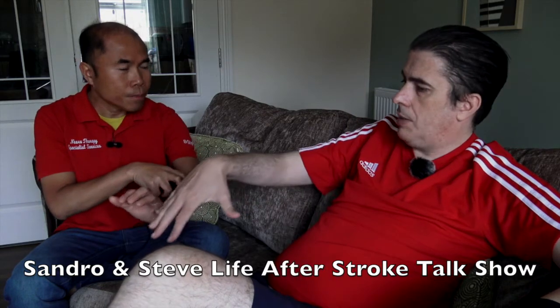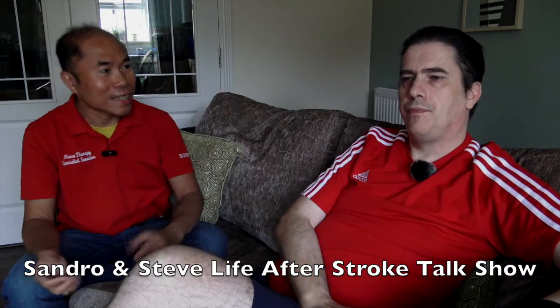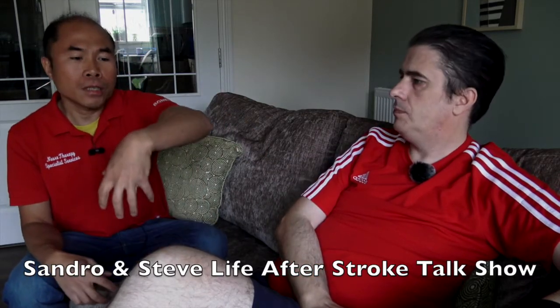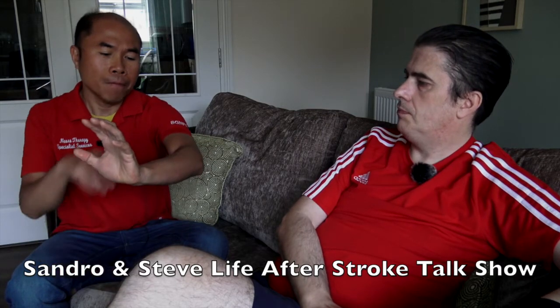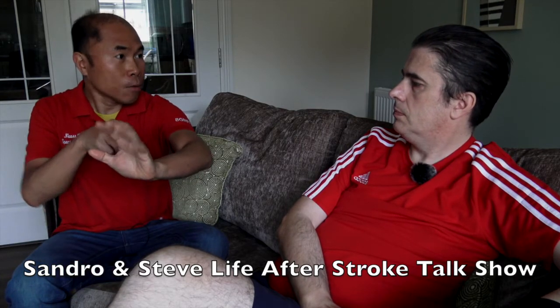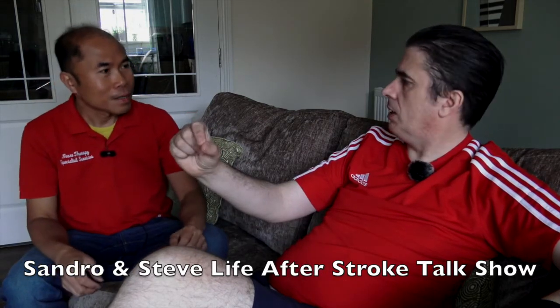So each time I'll get my hand about there. Yeah, and then the electricity will carry on the rest. And what you can even do is try the electricity lifting your wrist like that, and then reduce the intensity, but you keep it up like that. So it's got different tensions on it.